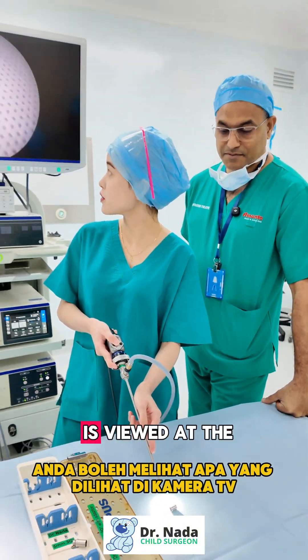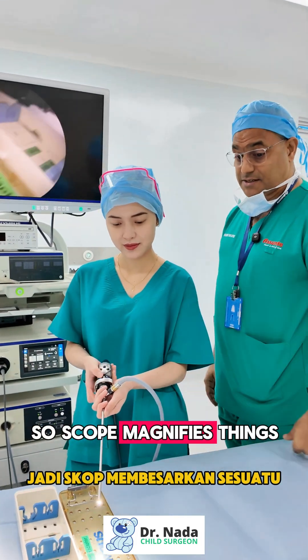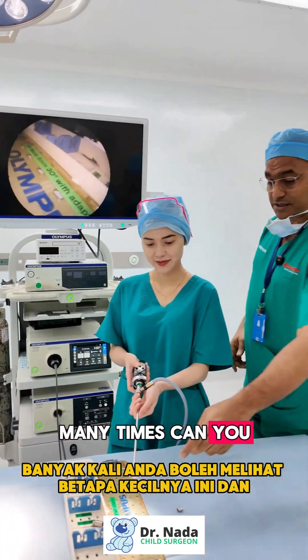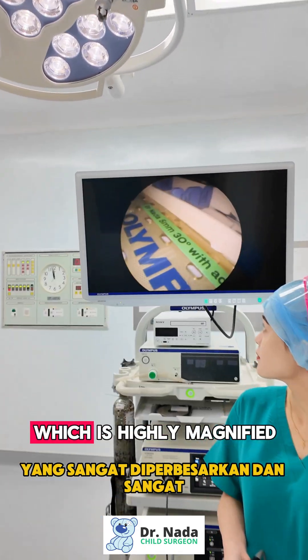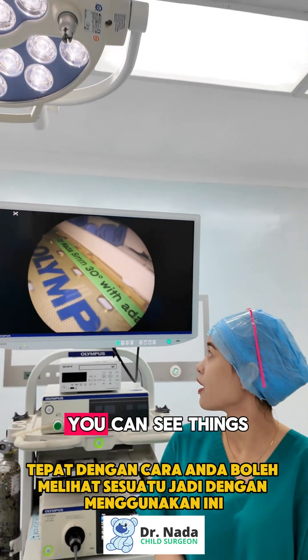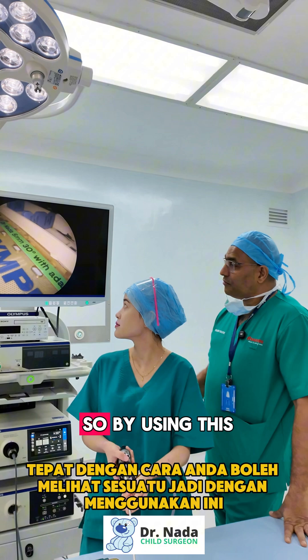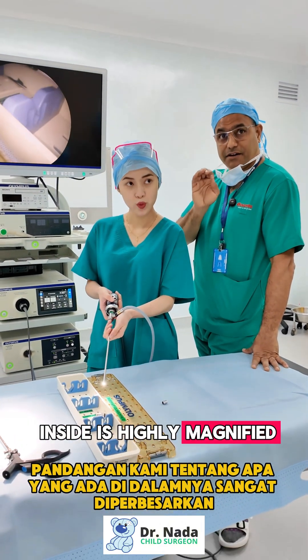The scope magnifies things many times. You can see how small this is in real life, and how magnified it appears on screen. We have a 4K system here which is highly magnified and very accurate in the way you can see things, giving us a highly magnified view of what's inside.